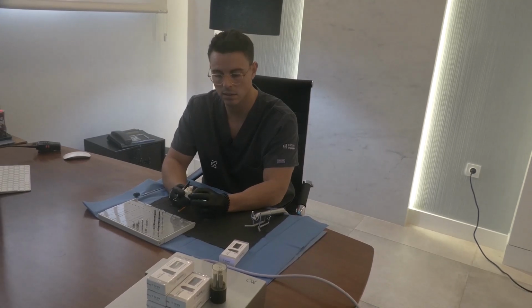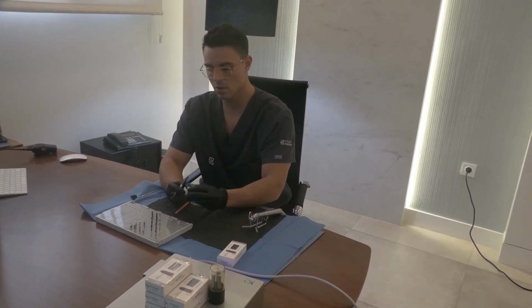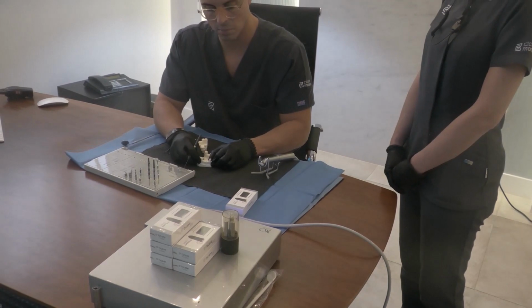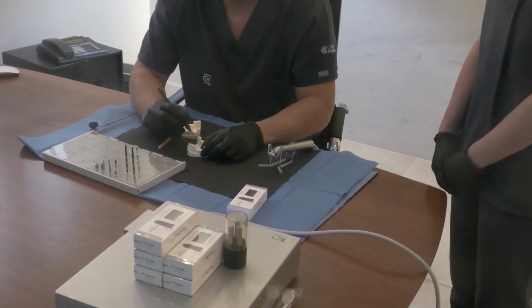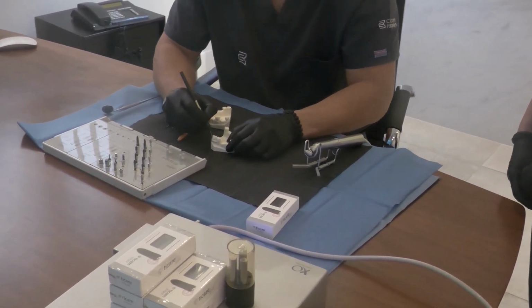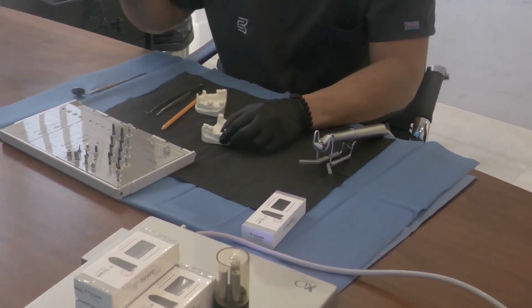But having said this, it is important to always remark that implant position has to be driven by the prosthetic emergence profile in order to provide a harmonious outcome. So now we're going to start the implant placement stage in a molar site. Again, you have to use a probe or a caliper in order to anticipate at least 1.5 millimeters. But of course, the implant position has to be driven by the emergence profile. In a molar site, it's going to be about 6 millimeters from one side and 6 millimeters from the adjacent side, in order to place the implant in the center.